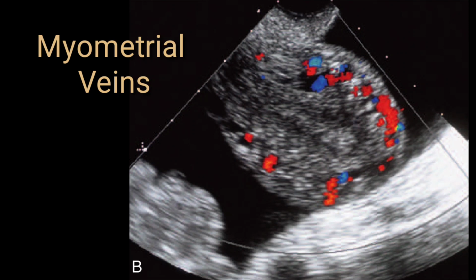Here the myometrium is okay, although homogeneity is not quite clear because of the vascularity, but normally the myometrium happens to be homogeneous and there should not be any fibroid activity or any other pathology. Sometimes you can appreciate calcification, sometimes there are multiple cystic lesions within it, or many other abnormalities can give rise to heterogeneous myometrial echogenicity.